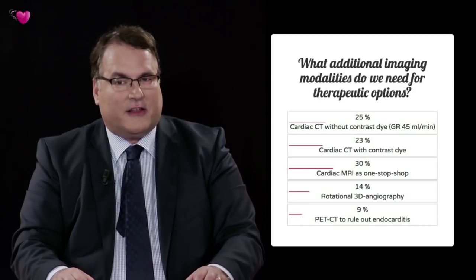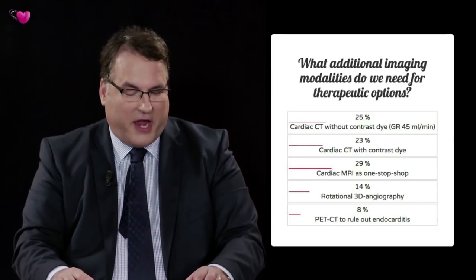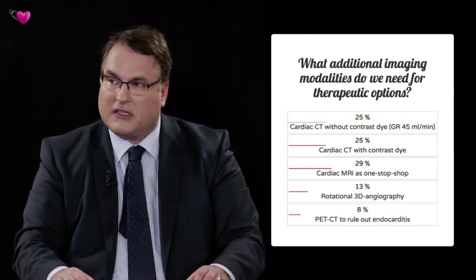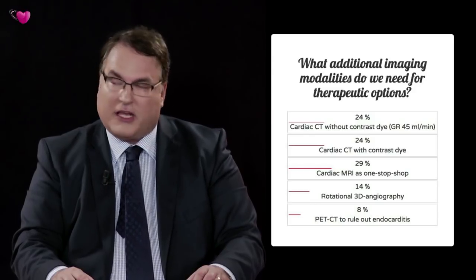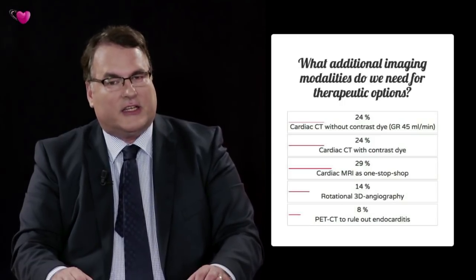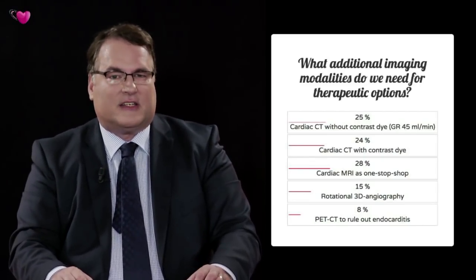And actually there are 3 major choices, interestingly a pair between cardiac CT without contrast dye, perhaps referring to the calcium that could also be depicted without any contrast, and cardiac CT with contrast dye. Together they gain 50% of the votes and are equivocal, and cardiac MRI has been voted for in 29% of the cases. So quite an interesting result on this vote.